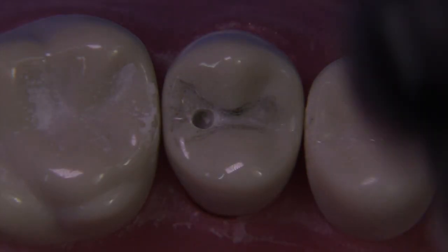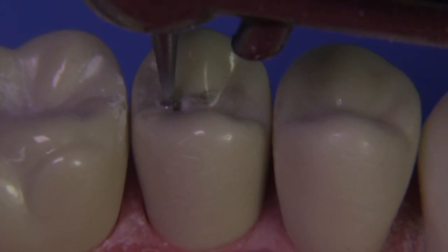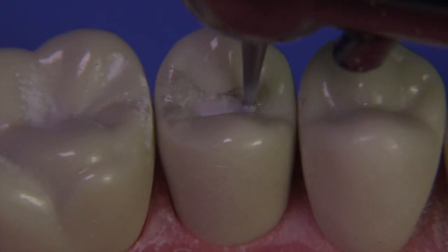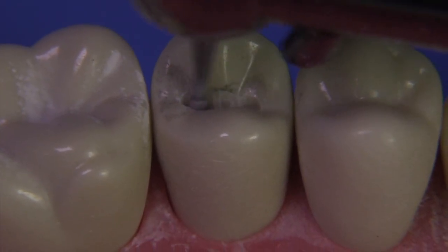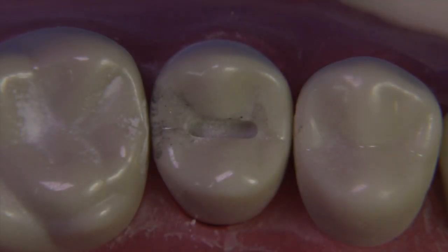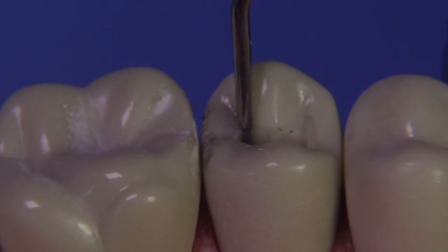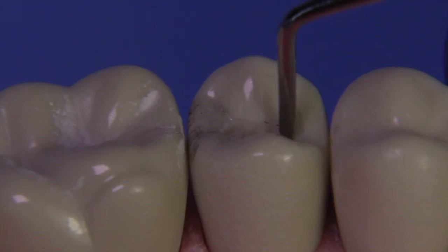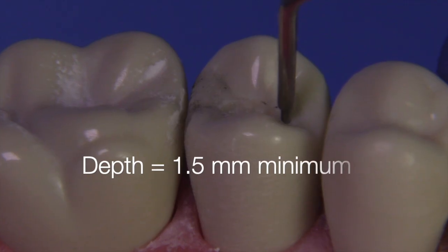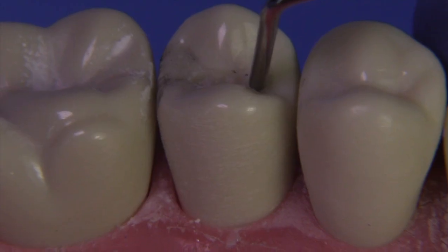The punch cut is made 1.5 millimeters in an area that does not get too close to your proposed outline form. Then we're just going to move the burr mesially at the same depth — 1.5 millimeters. At this point, you're ready to extend into the dovetail area and create that little lock. This is the RGS-1, and we can confirm we have at least 1.5 millimeters, which is the requirement for Class II amalgam preparations. Composites can be a little more shallow.